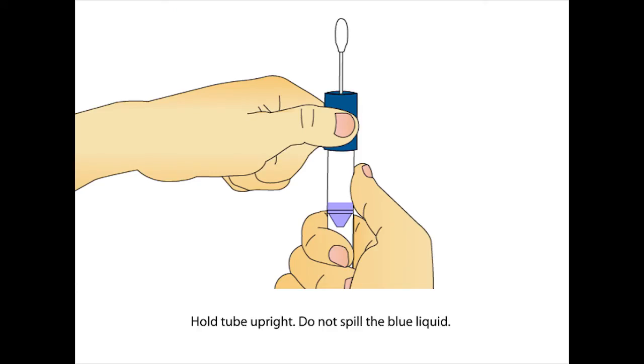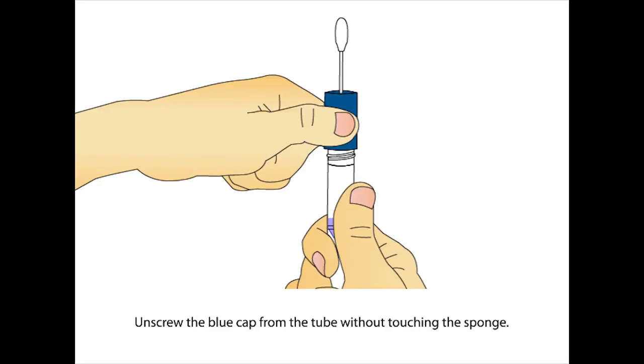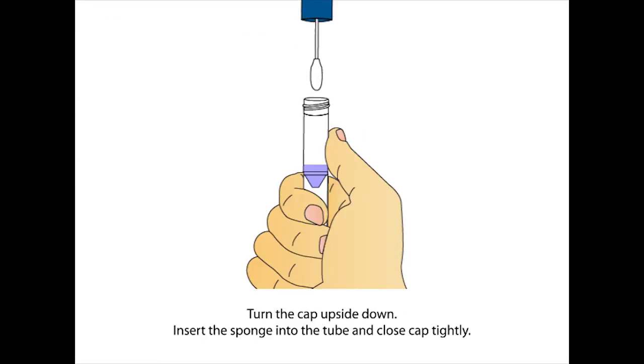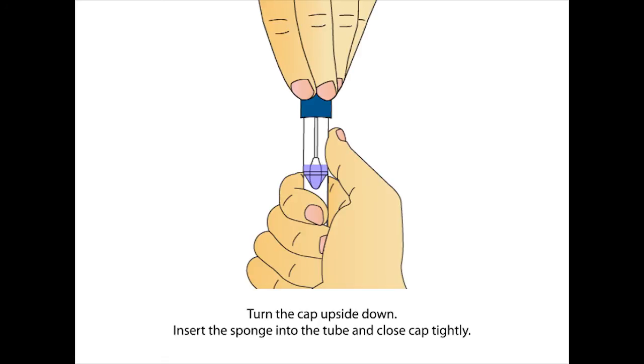To prevent the blue liquid inside the tube from spilling, hold the tube upright. Unscrew the blue cap from the tube without touching the sponge. Turn the cap upside down. Insert the sponge into the tube and close the cap tightly.